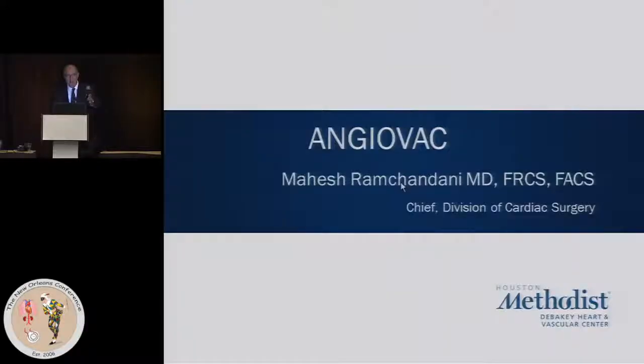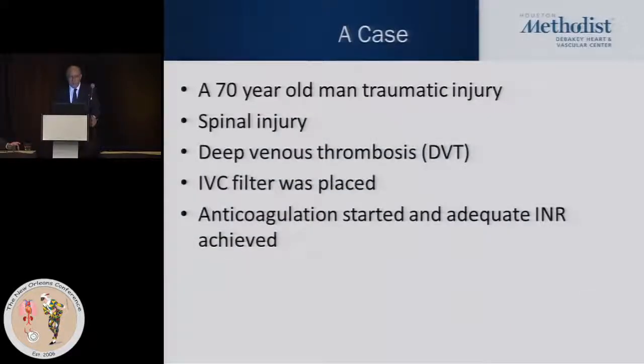So I've been asked to speak about the AngioVac, and let's start with a case. You've got a 70-year-old man who had a traumatic injury, spinal injury, and developed a deep vein thrombosis. An IVC filter was placed, anticoagulation was started, and an adequate INR was achieved.